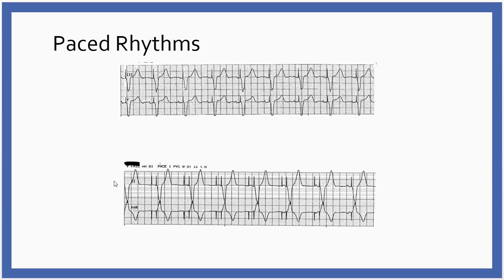Now, when you look down below, this is what's called AV pacing, or atrial and ventricular pacing. How do I know? I see two pacer spikes. This first spike is to stimulate the atria, so I get a little atrial contraction. And don't worry that you don't really see anything here, because remember the atria is teeny tiny. Now the pacer is programmed, and this one says 61, so the pacer is probably set at 60. The pacer is monitoring both atria and ventricle. If there's no intrinsic stimulus from the atria, it'll stimulate the atria, and that's what we see.